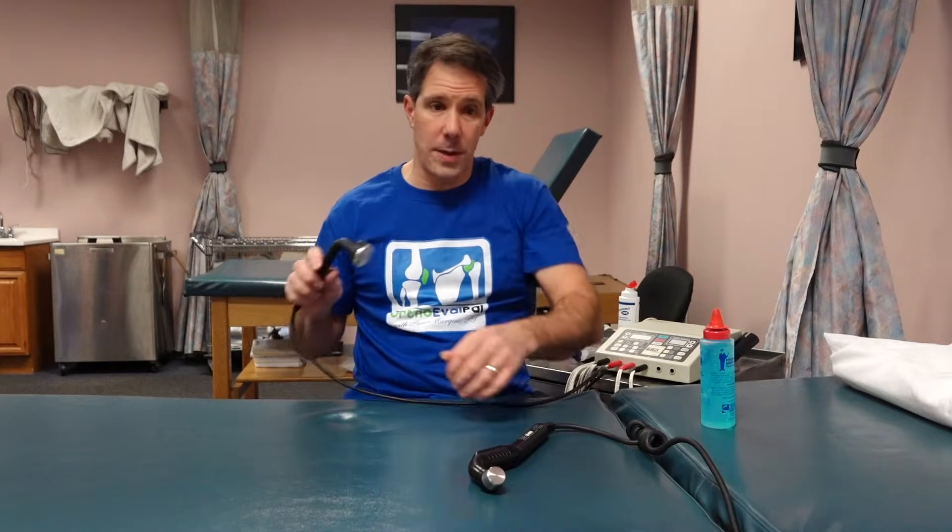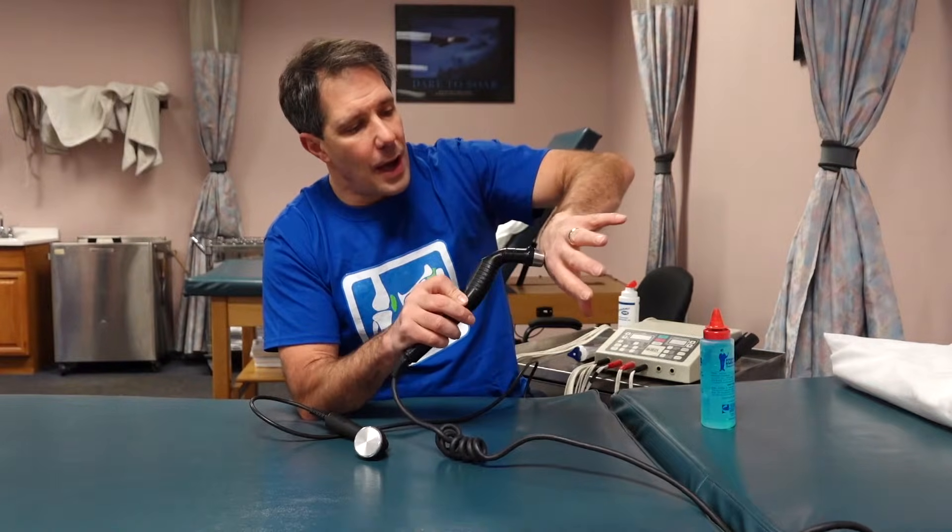Looking at these two ultrasound units, the sound heads are two different sizes. If you're doing a really large area — like a quad, piriformis, or lateral epicondyle — you'll want a larger sound head. If you're doing something like de Quervain's or just one specific tendon, you'll want a smaller sound head. You can see the difference in size between the two.